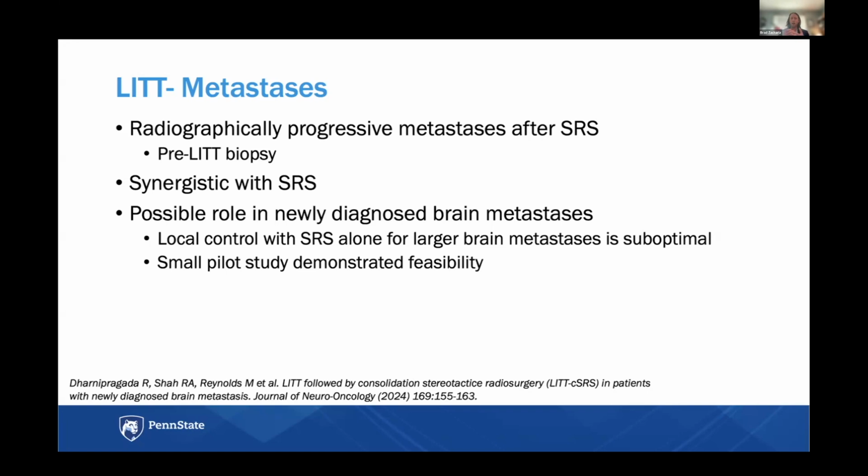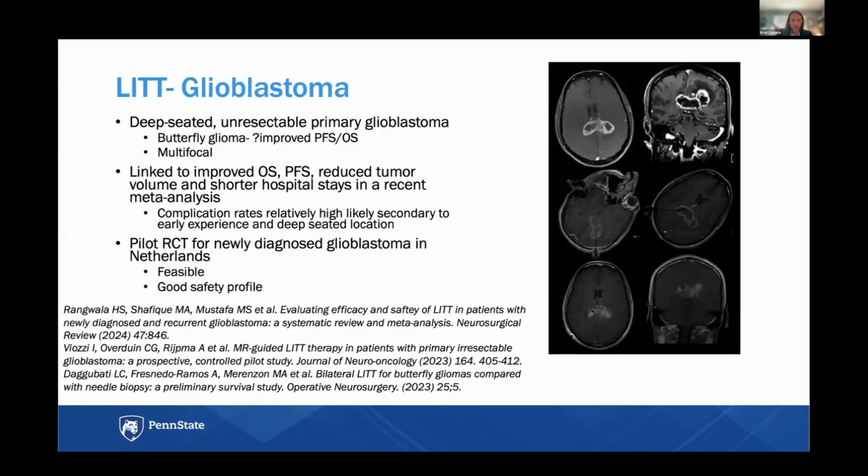Right, there's some question of how good the local control is with SRS alone for larger brain metastases, and so people are working on a small pilot to do preoperative LITT followed by SRS to see if we can get some synergy between those two. Again, I mentioned its use in glioblastoma. Upfront glioblastoma may not be amenable to other modalities, so deep-seated lesions, unresectable primary glioblastoma like the butterfly lesions you've seen here.